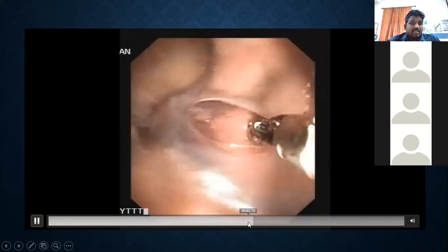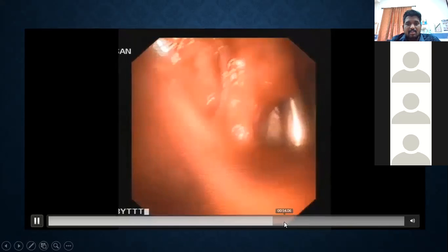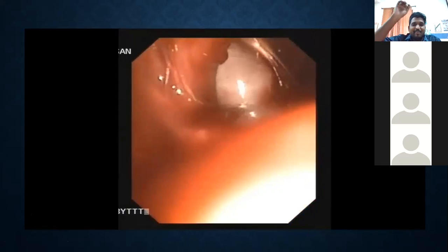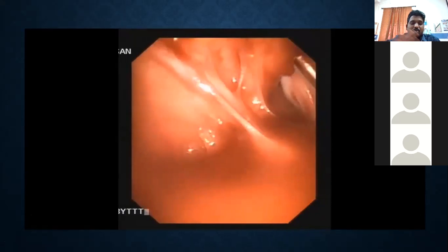So in the presence of adhesions, it is very difficult to locate that 5 centimeter foreign body. It's a thin wire. I'll show you. What we did is that we kept a fluoroscopy also. By X-ray, I'm seeing the foreign body, but once you see inside, I'm not seeing it, because inside is fully coated with all the adhesions.